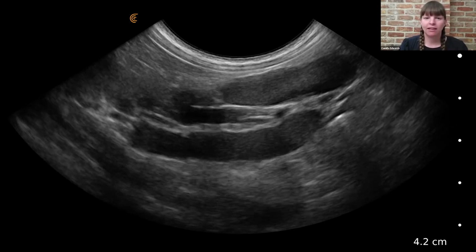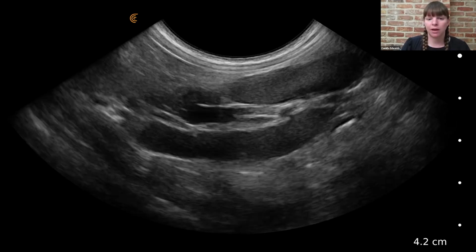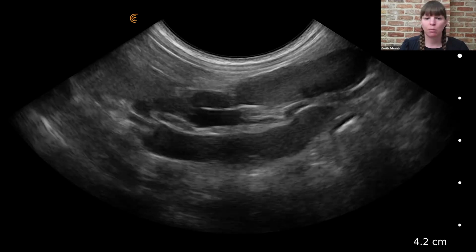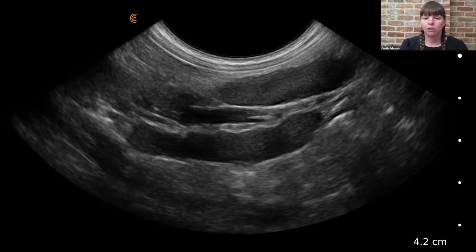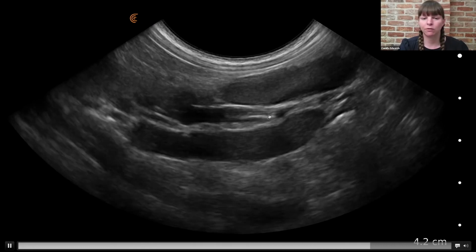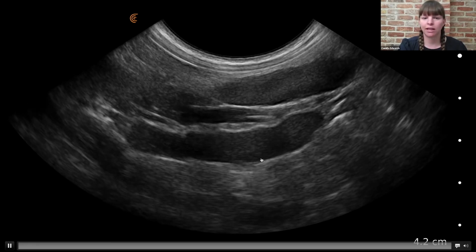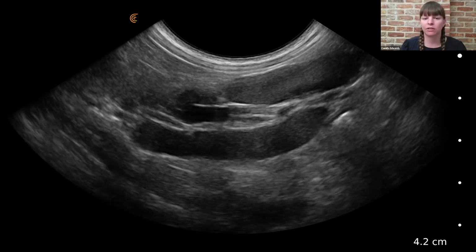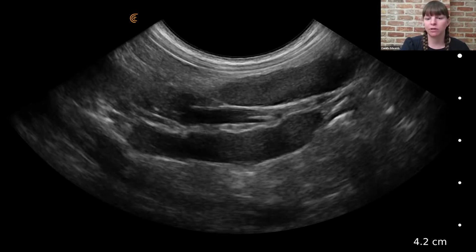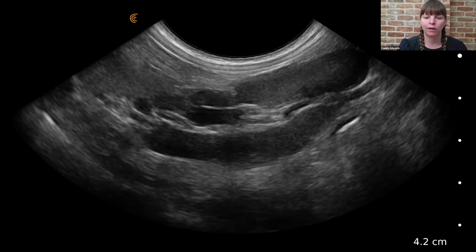Here, however, we've got a young dog, so only 10 weeks old, that we were scanning for urogenital problems, which turned out to be ectopic ureters. So we weren't expecting any problems with the lymph nodes really, but just to demonstrate how large lymph nodes can be in our younger patients, we've got the vessel running here in between, which is very characteristic for the jejunal lymph nodes. And then we've got one lymph node here and one lymph node here. And they're quite hypoechoic, dark in comparison to the surrounding tissue, and they're quite large really, and very prominent. So we expect to spot them in our younger patients, whereas we might not spot them in our older patients quite so easily.